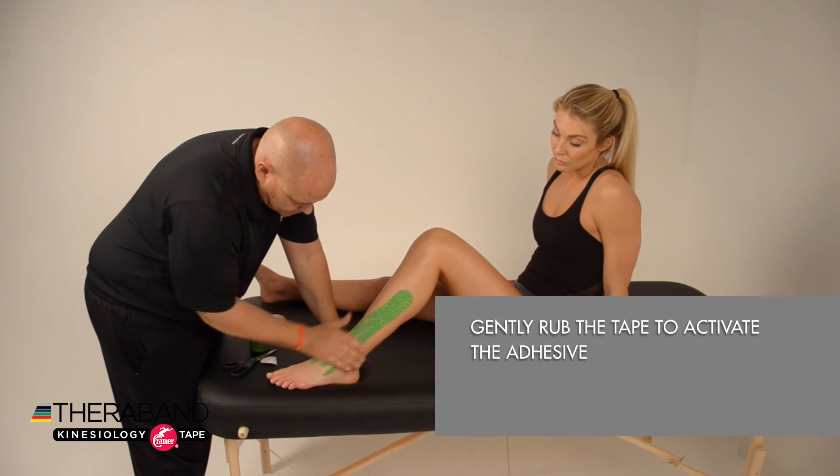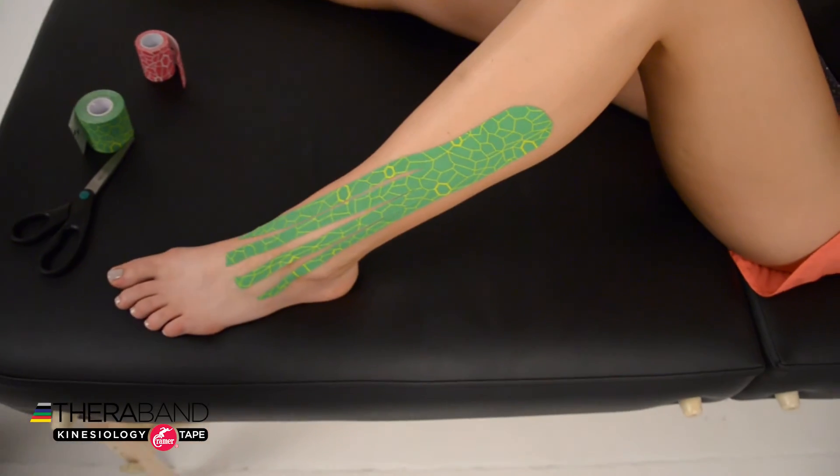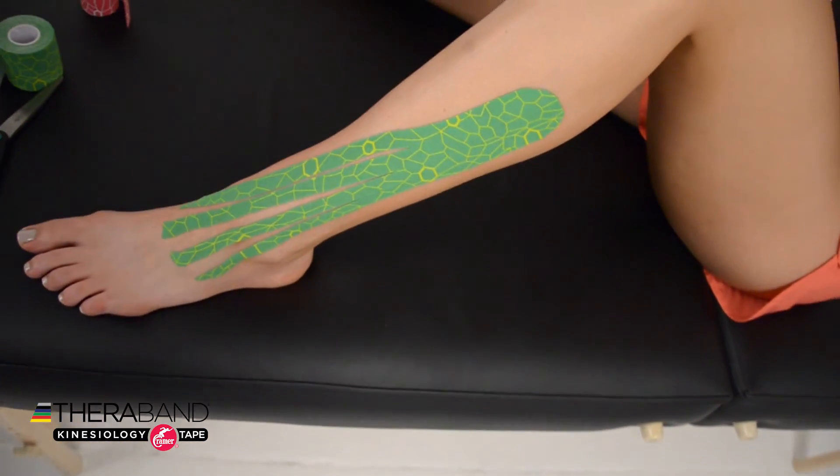Gently rub the entire tape job to activate the adhesive. And there we have our kinesiology taping for swelling and edema.